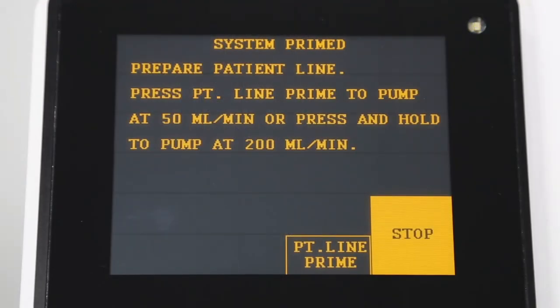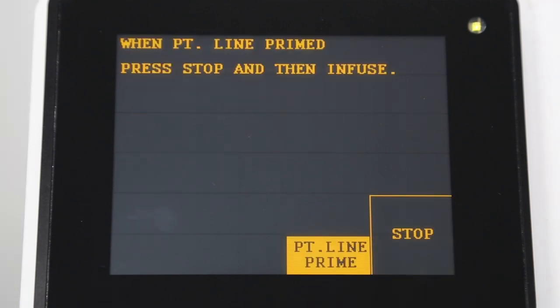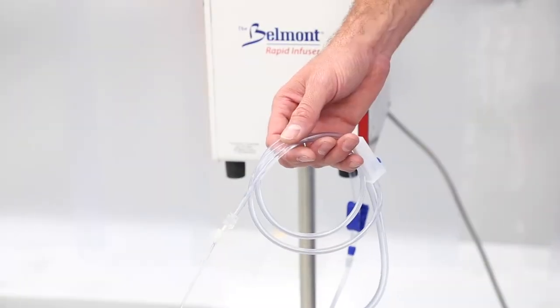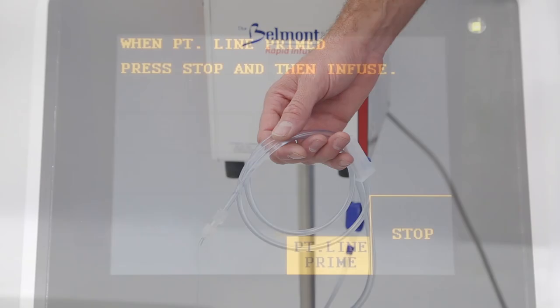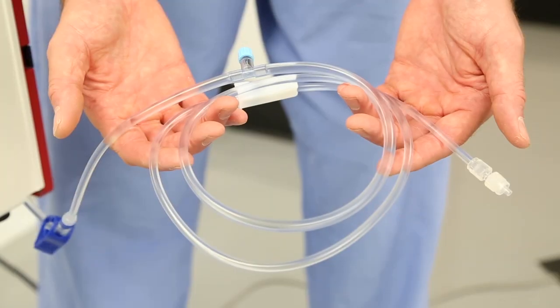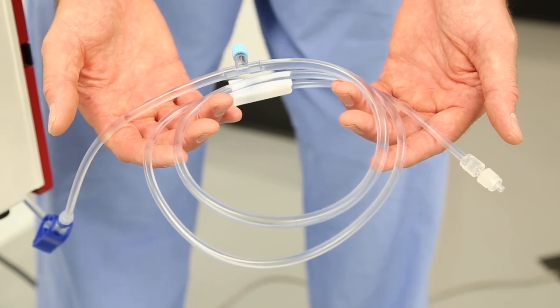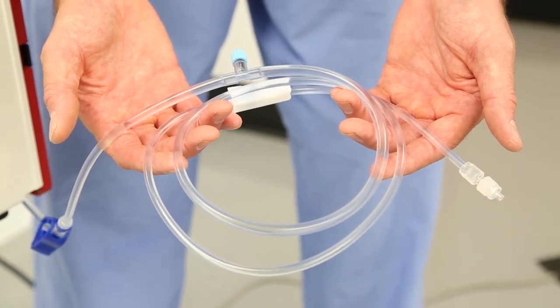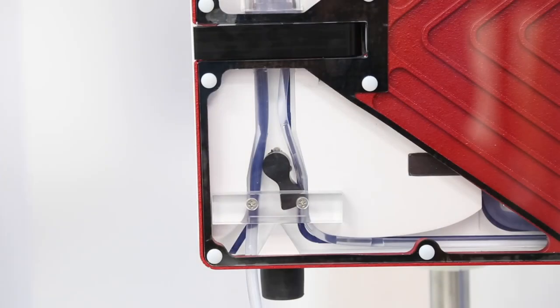The next screen will prompt you to prime the patient line. Press the patient line prime key once to prime at 50 milliliters per minute or press and hold the prime key to prime at 200 milliliters per minute. Press stop after you have confirmed all air has been purged from the patient line. The system automatically enters a standby mode until you are ready to connect to the patient's catheter. Before continuing, please inspect and make certain that the patient line is completely primed and free of air. Any air bubbles after the patient safety valve wand must be removed prior to patient connection.